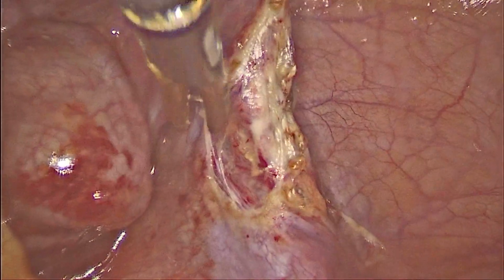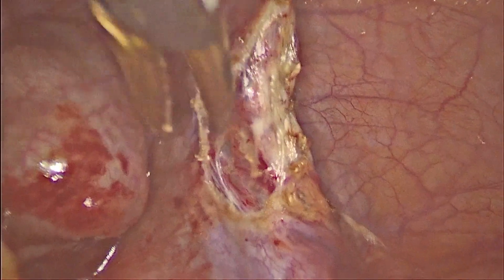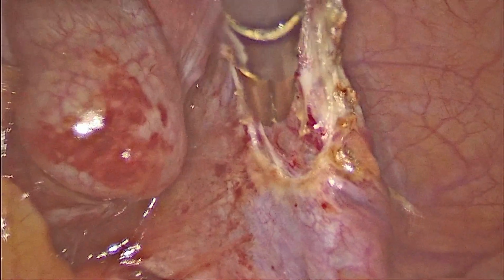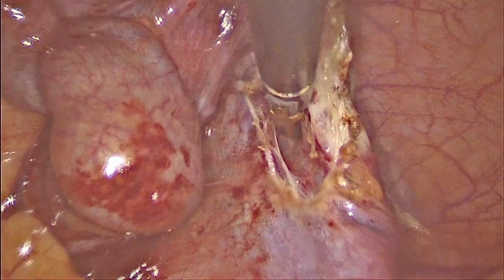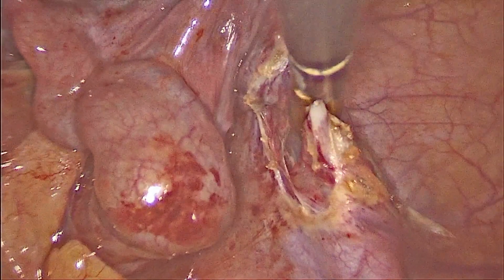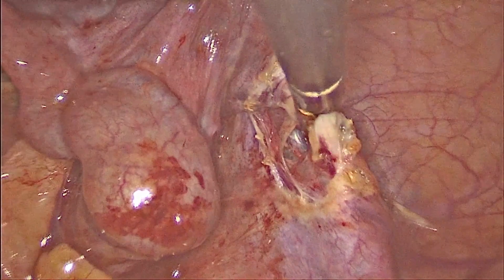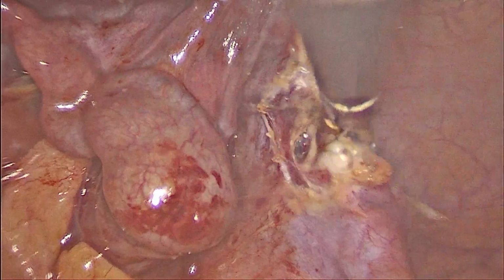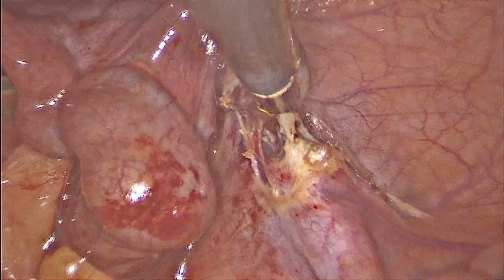Here the vessel sealing device, that is the bipolar shearer, is used to coagulate the vessel. Making a window between the ureter and the infundibulopelvic ligament is one more way to completely safeguard the ureter. We can see the edematous fallopian tube and the ovary stuck to the uterus. We are finding it difficult to dissect it away from the uterus.